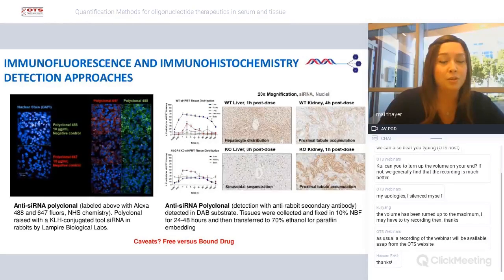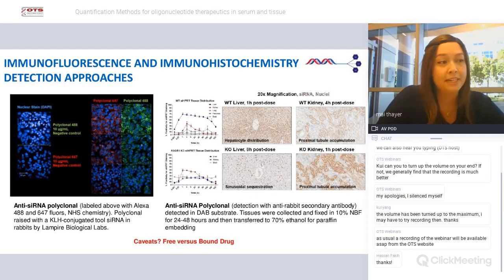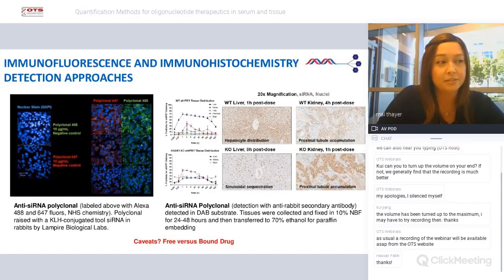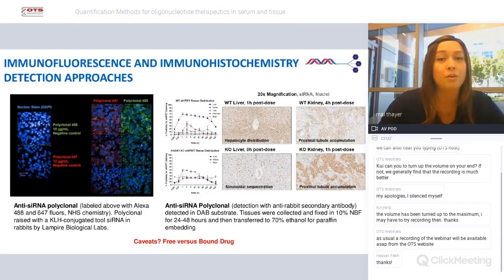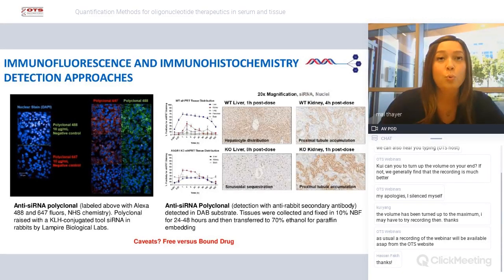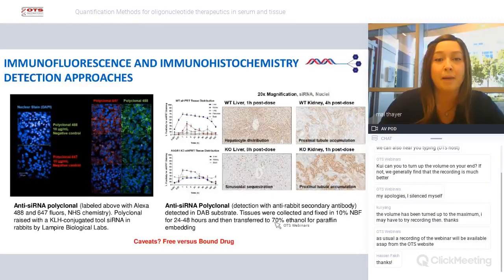We're seeing a dose-dependent signal with dose-dependent titration of our drug. On the right-hand side, the same reagent was used but a secondary antibody was used for detection. The upper panel shows a wild-type mouse dosed with GalNAc siRNA, and the lower panel shows an ASGR1 knockout. We know that ASGR1 is responsible for the uptake of GalNAc. When we remove it, we don't see signal accumulating in the liver — instead, it goes to the proximal tubules of the kidney — whereas in the wild-type mouse, we see most of the siRNA signal with the DAB substrate inside the hepatocytes.